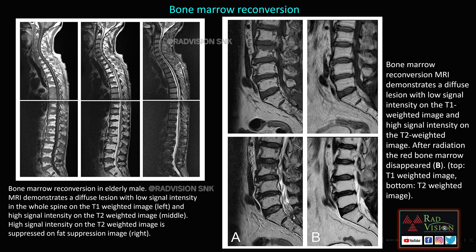Next — bone marrow reconversion. In elderly patients, yellow marrow can sometimes be replaced by red marrow. This red marrow typically shows low signal intensity on T1-weighted images, heterogeneously hyperintense signal on T2-weighted images, and fat-suppressed sequences will not show any edema. Bone marrow reconversion can be seen in the elderly and also in some hematopoietic disorders.